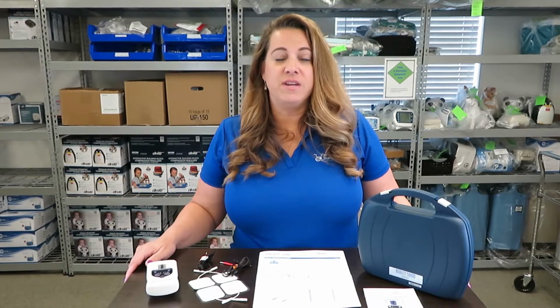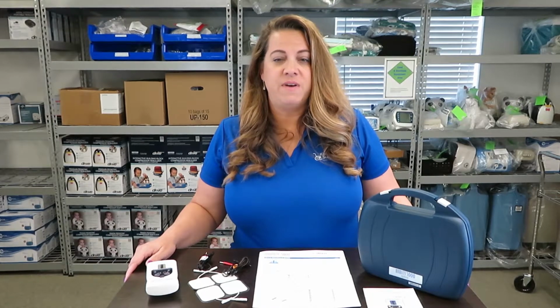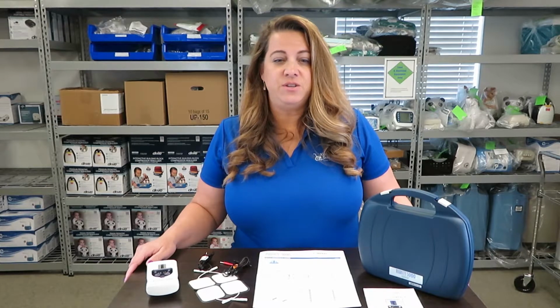Let's talk about the contraindications and warnings of using a TENS unit. If you are under the care of a physician, please consult them before using this device. Do not use this device if you have a cardiac pacemaker, implanted defibrillator, or other implanted metallic or electronic device. Such use could cause electric shock, burns, electrical interference, or death.